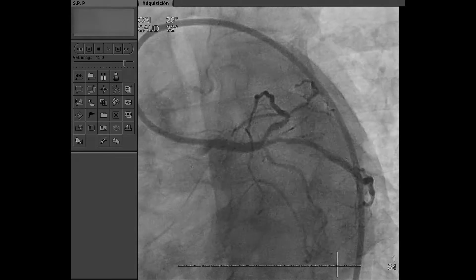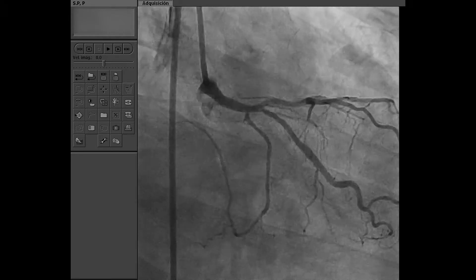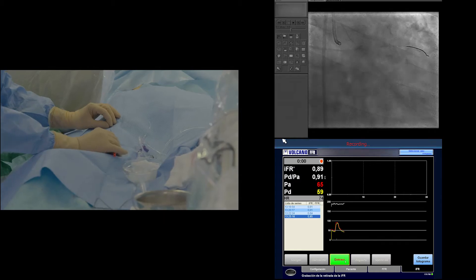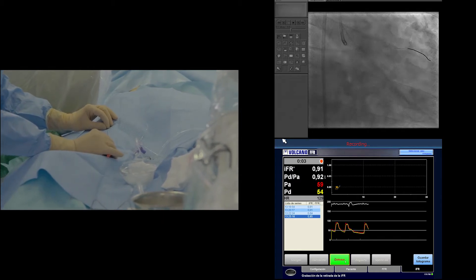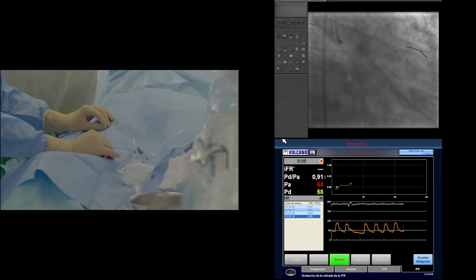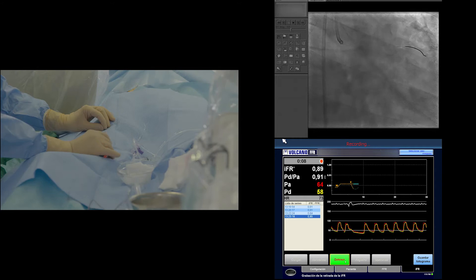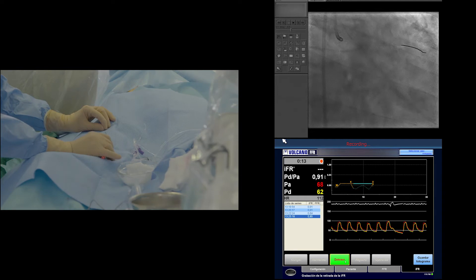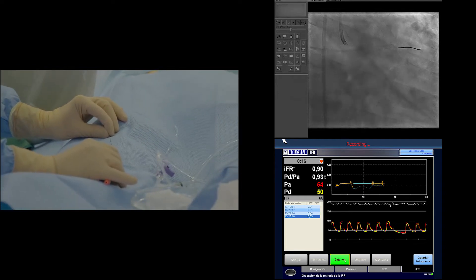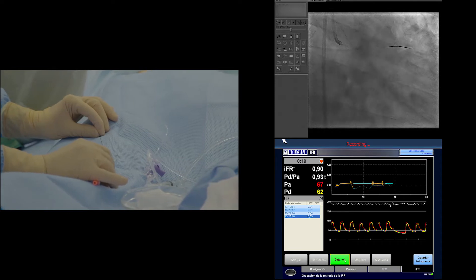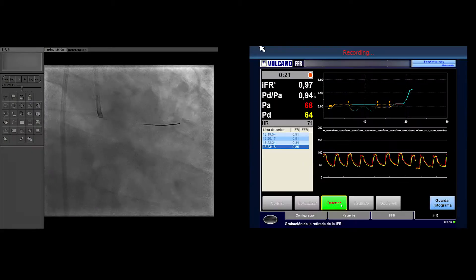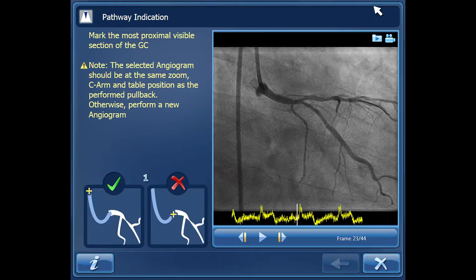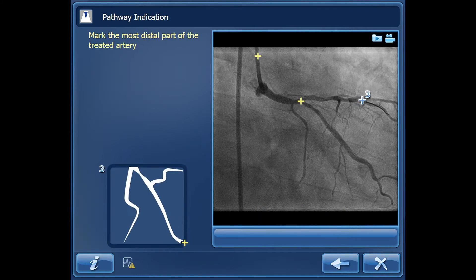Here we have the angiogram as we are about to perform physiological interrogation. With IFR, we have a perfect matching of both pressures before starting the measurement. We have crossed the stenosis with the pressure guidewire and are performing a pullback while recording, paying attention to the modification in the IFR ratio expressed as the blue line. We can see a brisk change that continues over a long segment of the vessel in terms of IFR values.